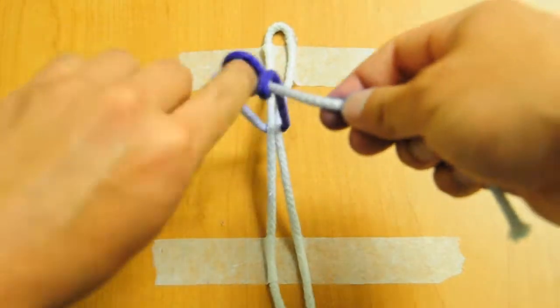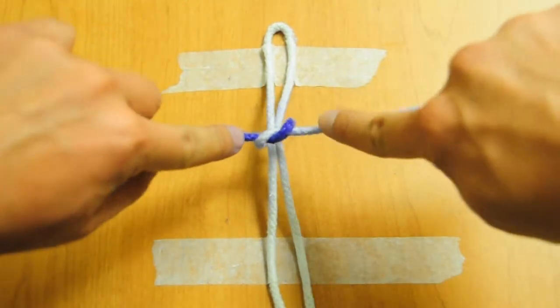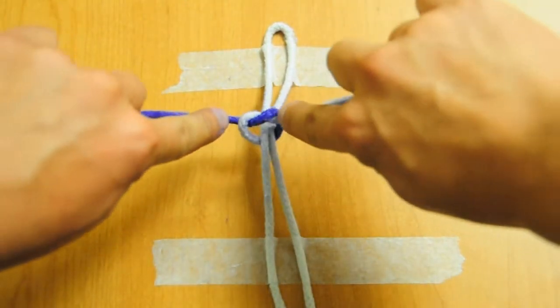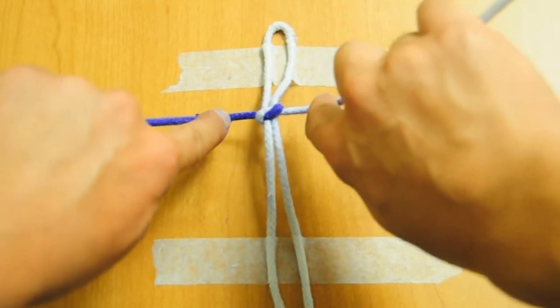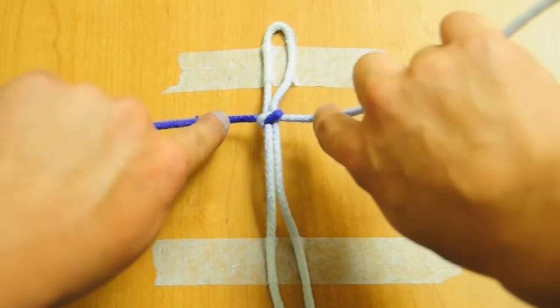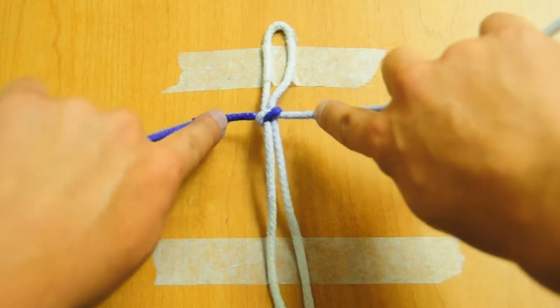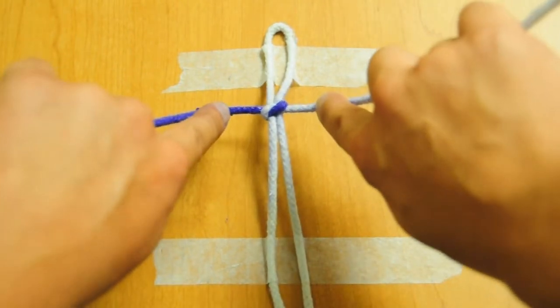Say here's your one-handed tie. You want to come down, equal tension on both sides, as close to the knot as possible. That way you get a lot of tactile feedback on your knot, see if it's cinching down anymore. You can tell when it's stopped cinching down, then the next thing it's going to do is break.